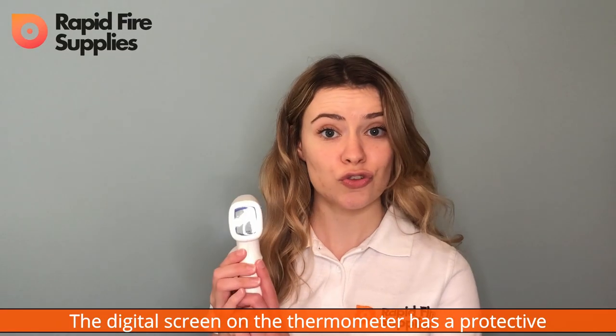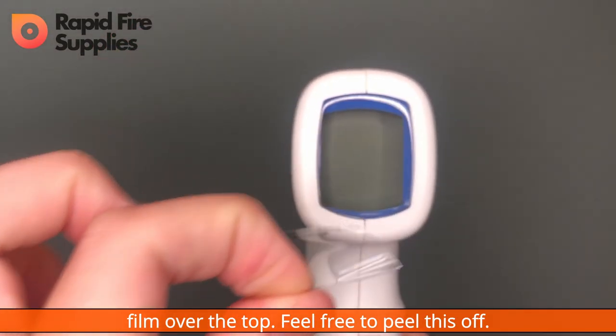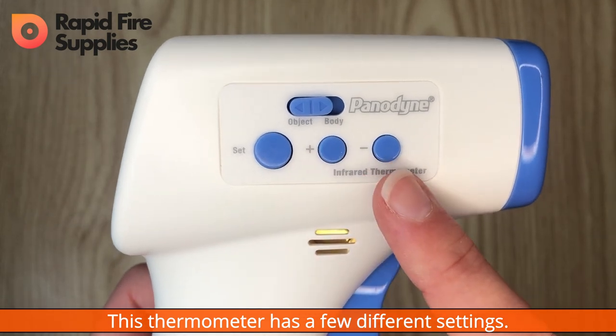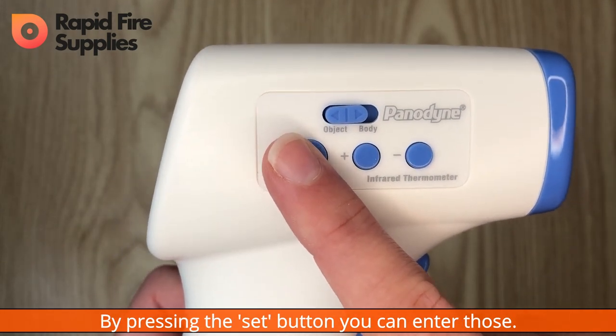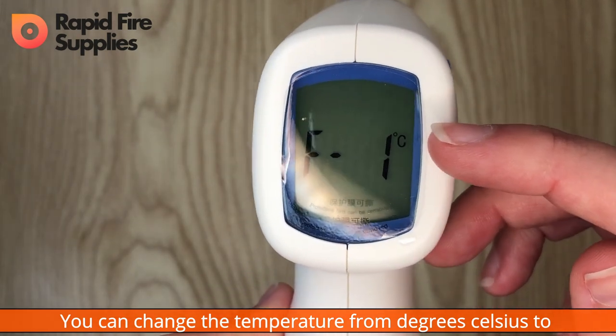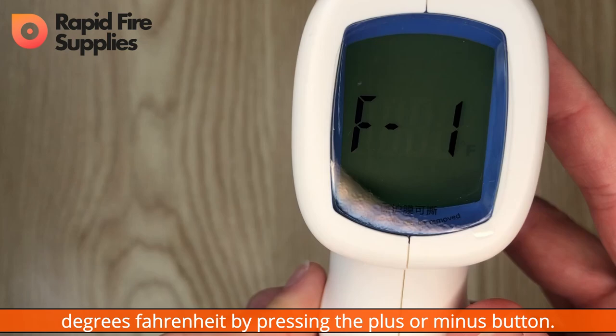The digital screen on the thermometer has a protective film over the top — feel free to peel this off. This thermometer has a few different settings. By pressing the set button, you can enter those. You can change the temperature from degrees Celsius to degrees Fahrenheit by pressing the plus or the minus button.